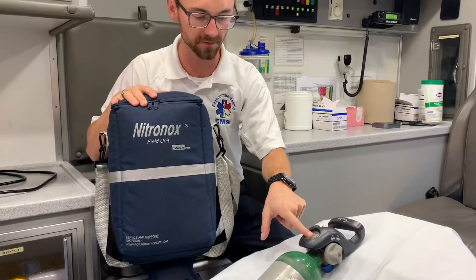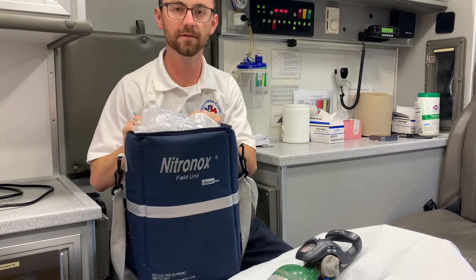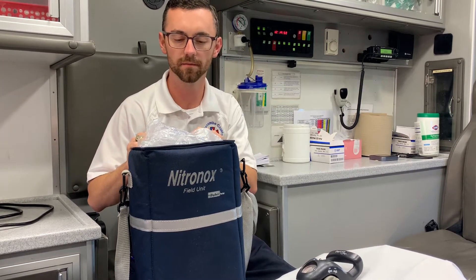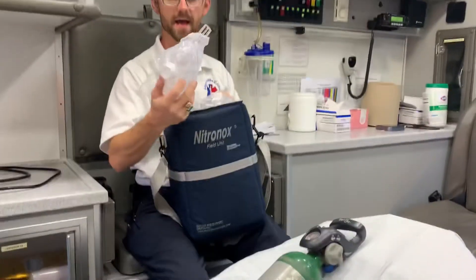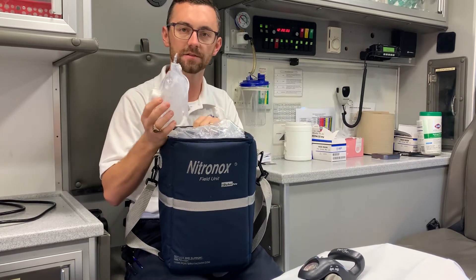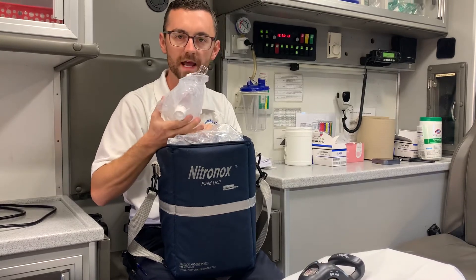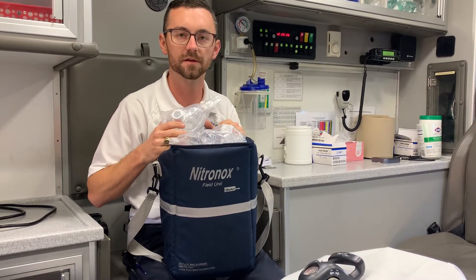We know the oxygen tank is full because we see the PSI on the front. When you open the unit, we have CPAP masks without the straps. This is a self-administered medicine — we are not to strap anything to the face. The patient has to hold the mask to their face, and when they are unable to do so, the mask will fall off and medication administration will cease.